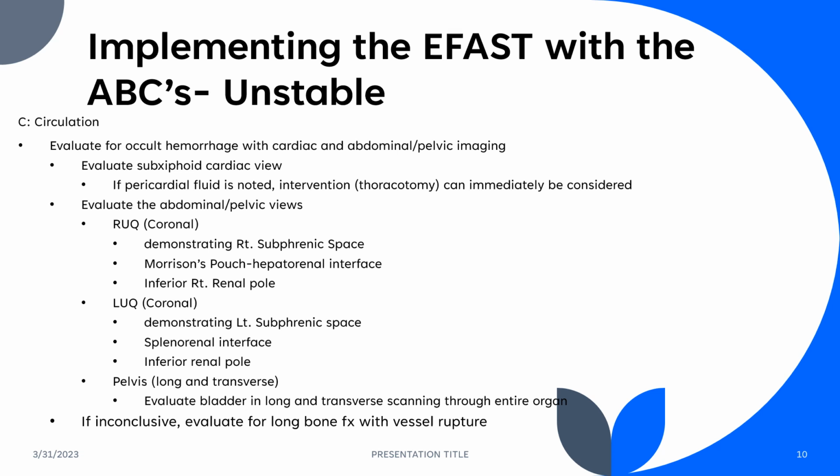And really, they recommend that all fluid collections are treated like hemopericardium until otherwise diagnosed. So if a pericardial effusion is noted, intervention can be immediately considered, allowing immediate treatment to that patient, removal of that pressure around their heart, looking for an improved patient outcome.